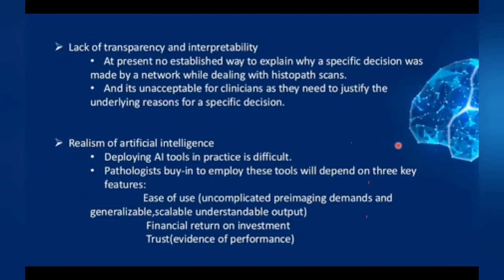Now, lack of transparency. It is very difficult to convince the clinician why this tumor would behave badly and why this tumor would behave in a good fashion just by machine learning. And it is very difficult to make him understand. And you cannot actually establish a way to explain how the results have come out. So there is a lack of transparency and interpretation. In the end, it is a little bit difficult to deploy the AI tools in practice.